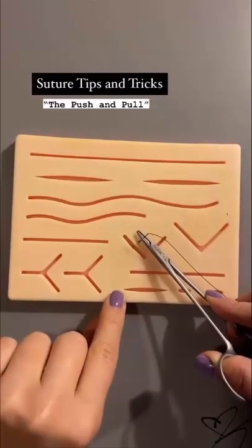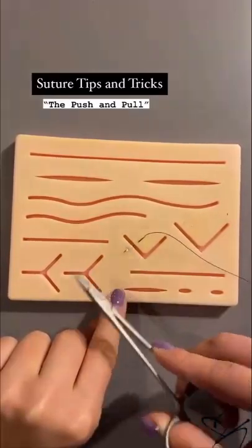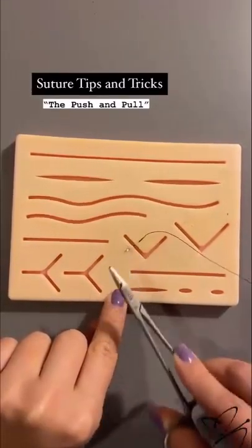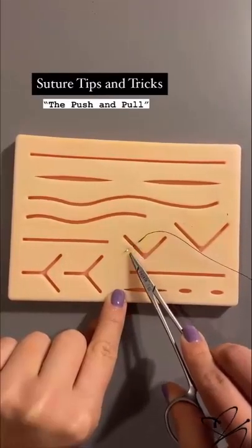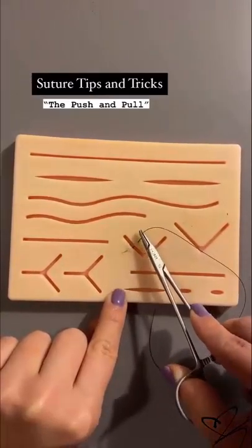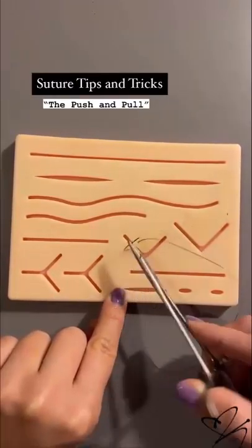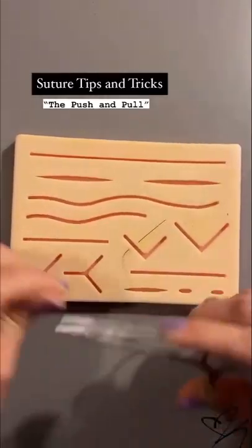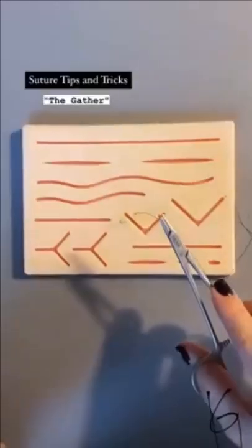When you go through the skin, it's really important to not grab your needle and pull — that's a really good way to mess up your needle and bend it. What you want to do is once you enter the first and second part of the skin, you push. The natural curvature of the needle is going to get the length that you need to pull it out and suture.